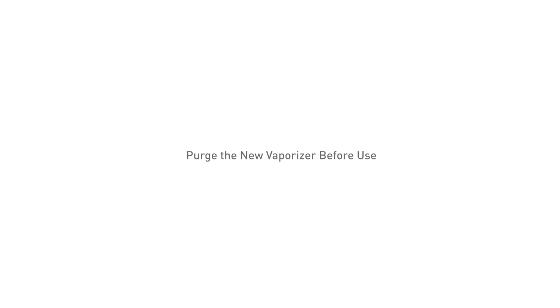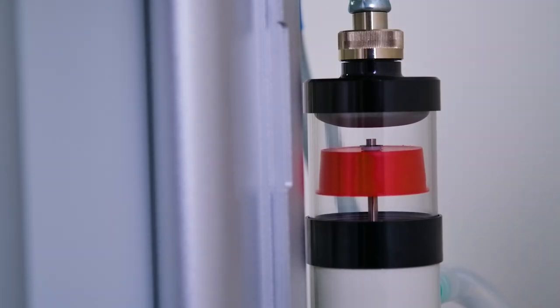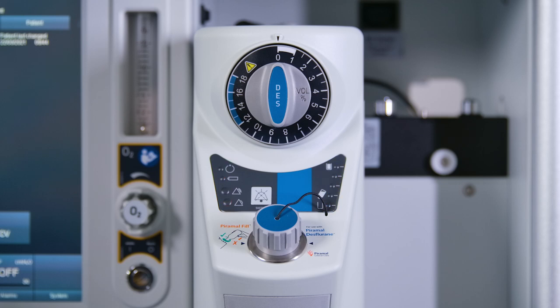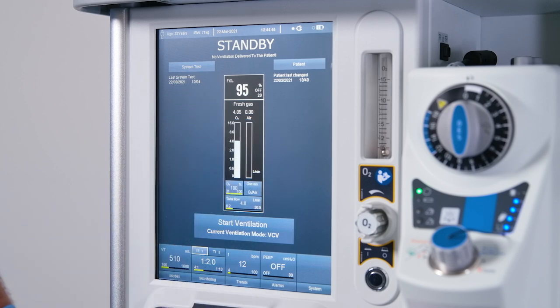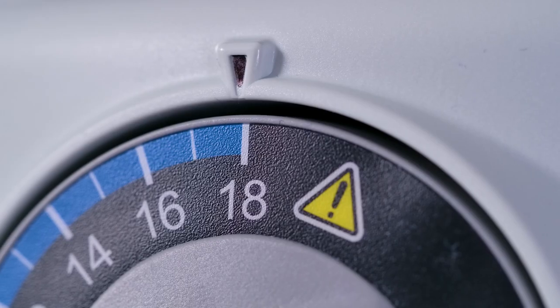Purge the new vaporizer before use. Before use on a patient, the vaporizer must be filled with desflurane and purged at 4 liters per minute fresh gas with a concentration setting of 18%. Purge for a minimum of 30 seconds. Mount the vaporizer on an anesthetic machine equipped with an anesthetic gas scavenging receiver. Connect the electrical power supply cable and fill the vaporizer with desflurane. Allow the vaporizer to finish warming up and enter standby mode, indicated by the power indicator being continuously illuminated. Set a fresh gas flow of 4 liters per minute on the anesthetic machine, set the concentration control dial to 18%, and purge the vaporizer for a minimum of 30 seconds.